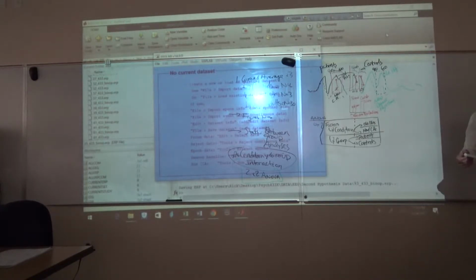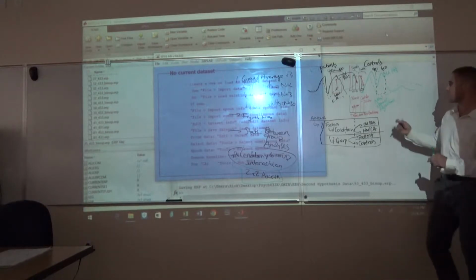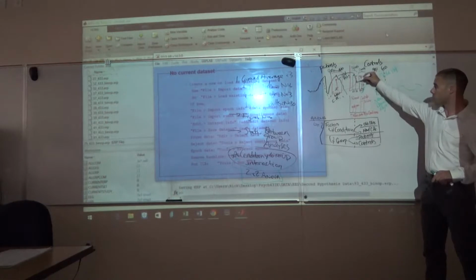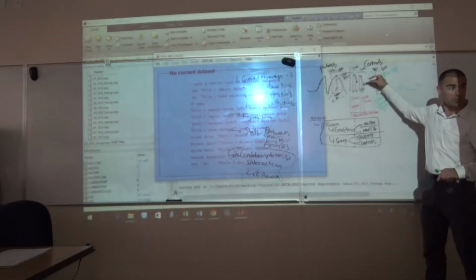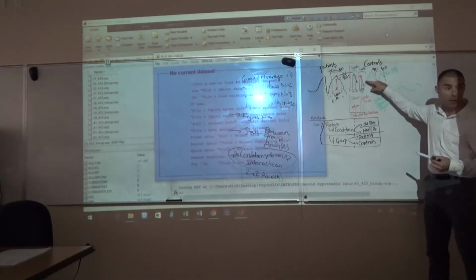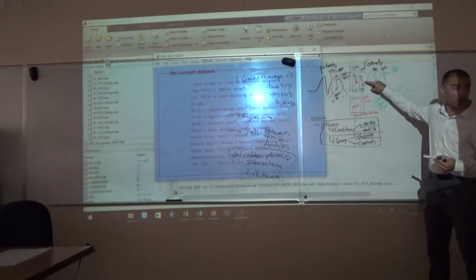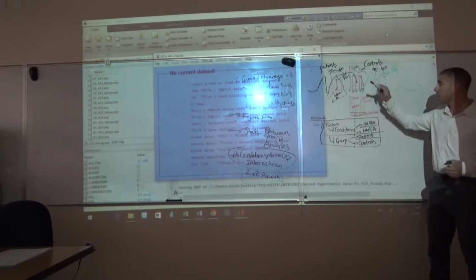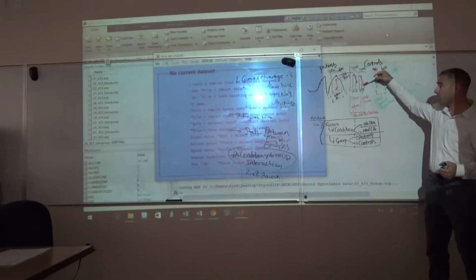No, it's when you moved away, I was able to see it. Okay, so this is just, see how this is shorter and this is taller? See how this is shorter and this is taller? You don't see that this red line is shorter than that red line? Oh. See, so it's red. Okay, see that red line is shorter than this red line?